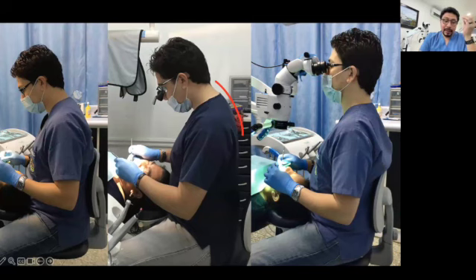With the loupes, I was seeing better, but I started feeling pain in my neck, because these loupes were not personalized. They were just very cheap, regular loupes at that time, and the microscope will change your position. But with the regular microscope with the binoculars, you need to stay straight in the same position all the time, which is good, but we are not going to be free enough for performing some treatments.